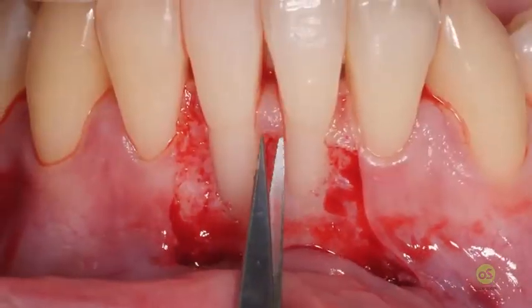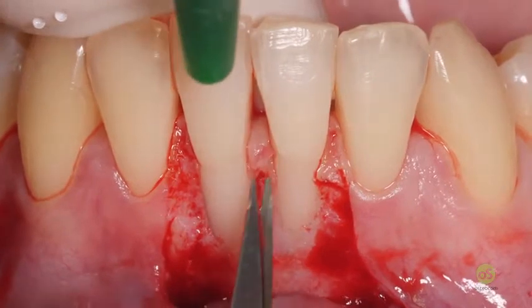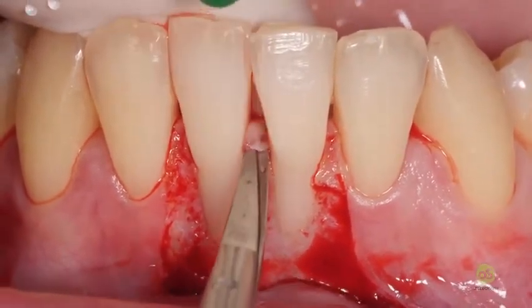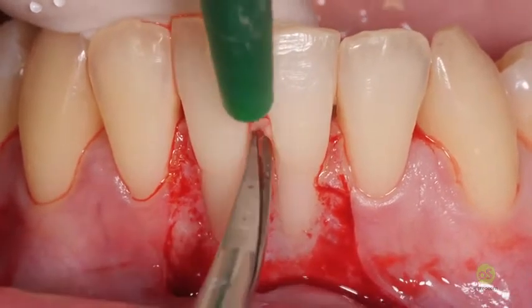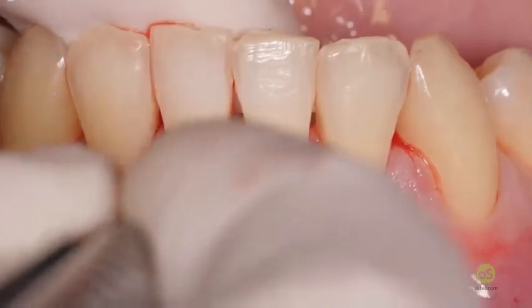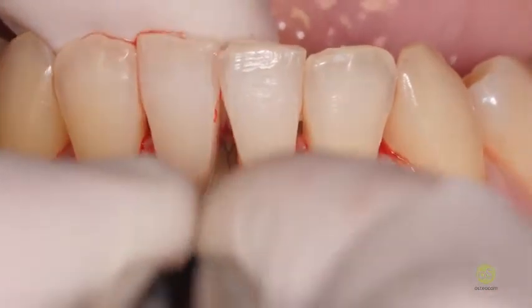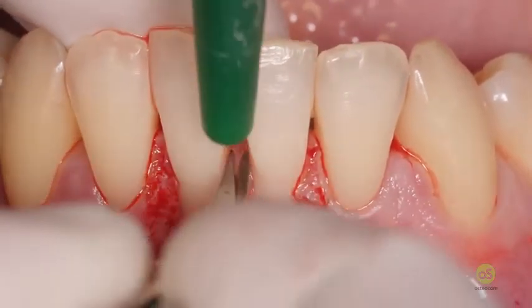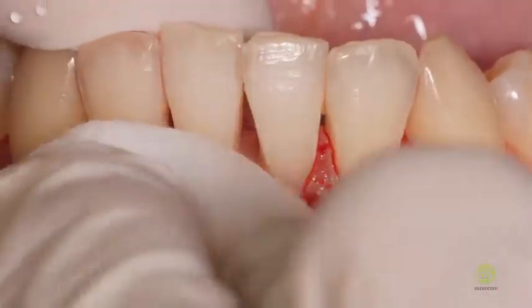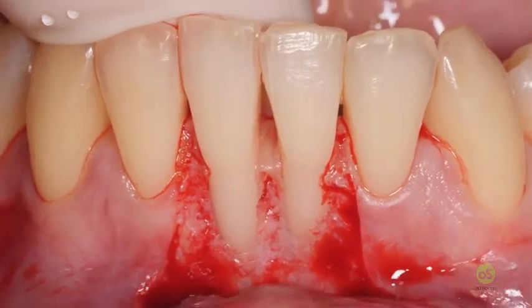Now I keep the fingers on the lingual aspect in order to complete this desepithelialization on the occlusal surface. So to increase the blood supply towards the lingual aspect at the level of the interincisor papilla that was lost in height, we have to increase the occlusal aspect for the desepithelialization.